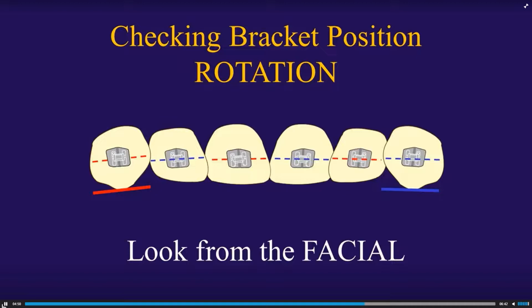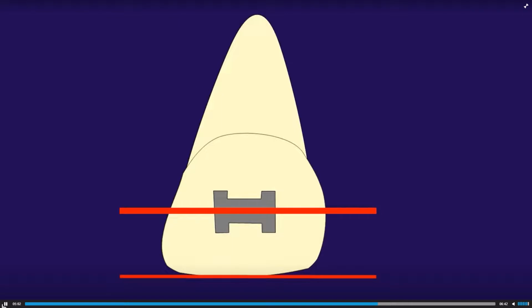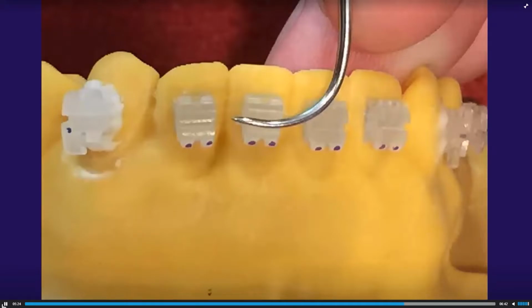Okay, now you're going to check your bracket rotation from the facial. Make sure it's rotated properly, counterclockwise, clockwise, okay? And it should look basically something like this. A good way to think about it is you want your bracket slot parallel to your incisal edge. Another way of thinking of it is perpendicular to the long axis of the tooth, right? Or the long axis of the bracket slot, okay? That's harder for some doctors to visualize, though, in the mouth. Okay? And you can just take your instrument. Make sure that bracket slot is parallel to the incisal edge, okay?